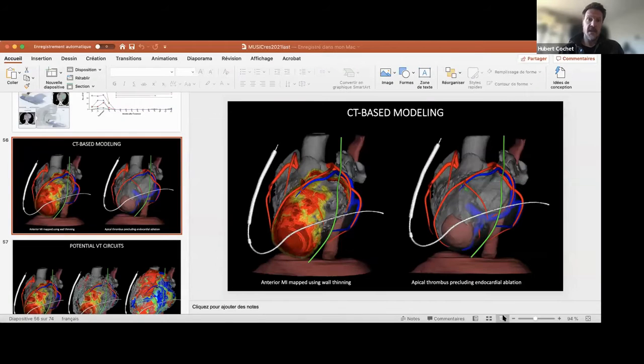We've been doing that, so it's not something that is part of InHeart products, but I can comment on that because we're doing research on that. InHeart does 3D modeling, and we can use these 3D models to assist stereotactic radiation therapy. But for that, you need specific software in order to trace the targets, register electroanatomical maps and everything. This is not yet part of InHeart products, but maybe I can show what we're doing in that prospect. So it all starts with the InHeart models.